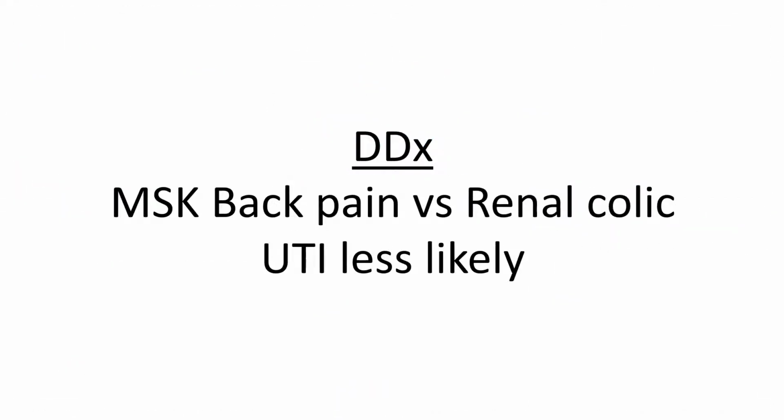So, after your history and physical, the differential diagnosis is already boiled down to MSK back pain versus renal colic, with urinary tract infection being less likely.